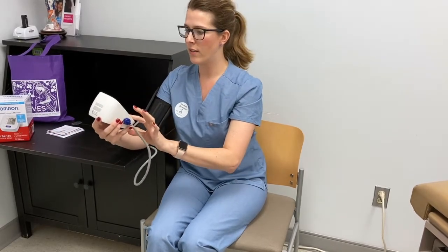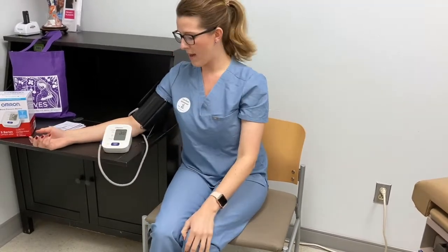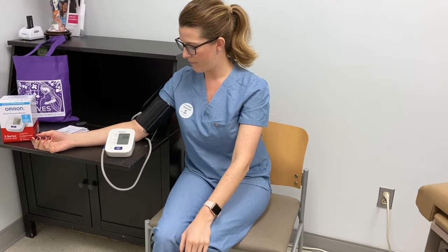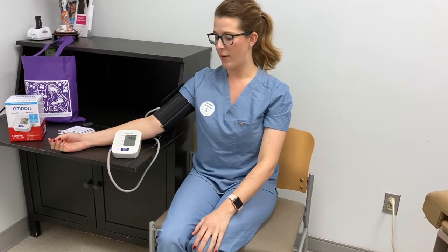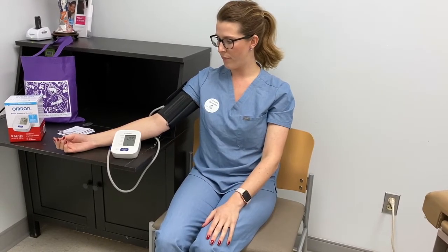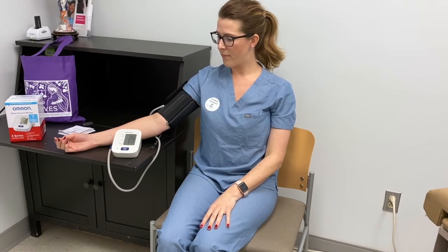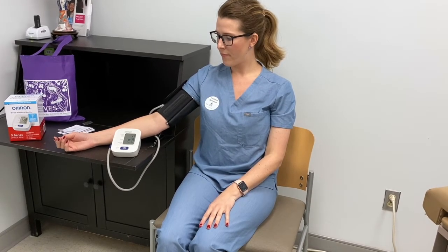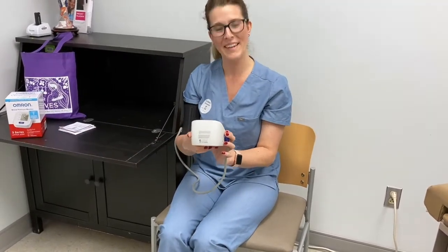Next, we press start, stop to turn it on. And it automatically starts pumping. So start, stop is power, and it's also go. It's all you have to press. Relax my back into the chair, my feet are flat, and my arm is at table level. You'll also notice that this means that the blood pressure cuff is in line with my heart. That's important. Great. Gave me an error. Let's try again.